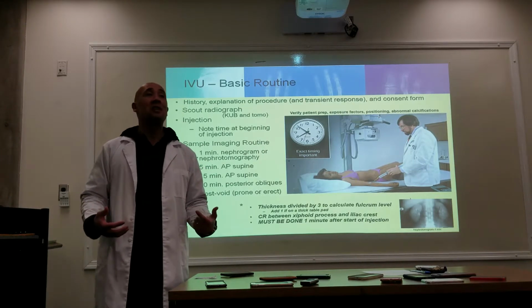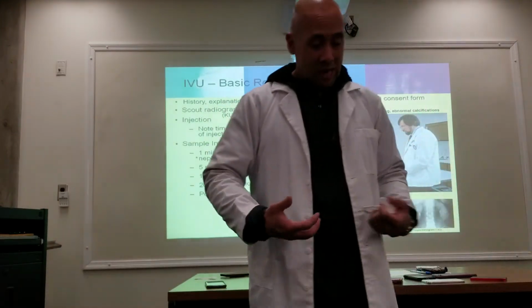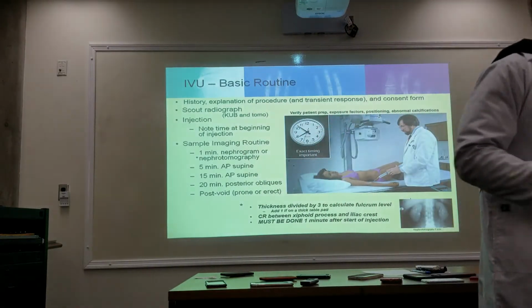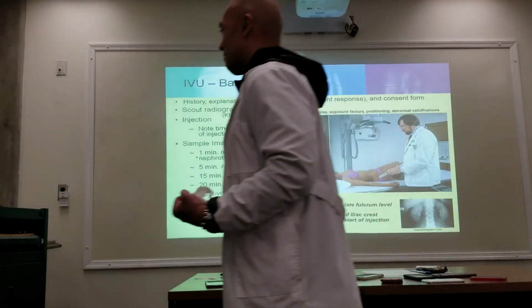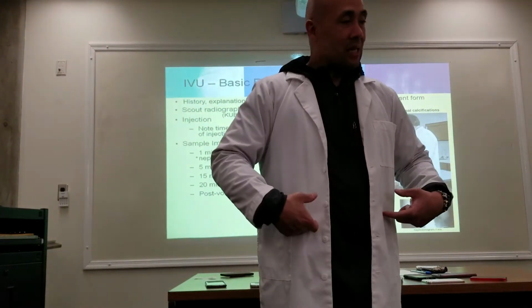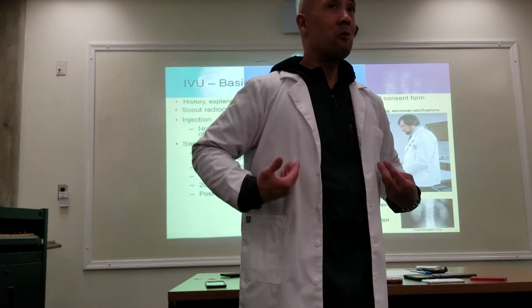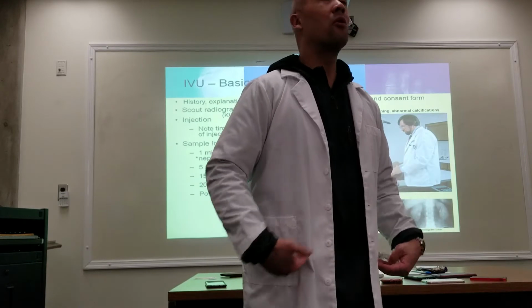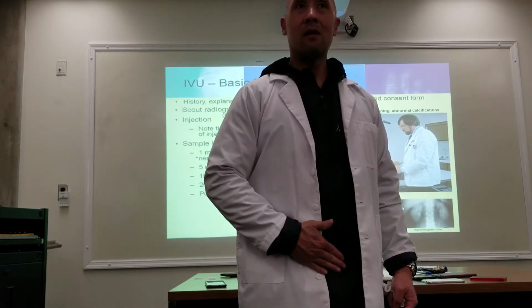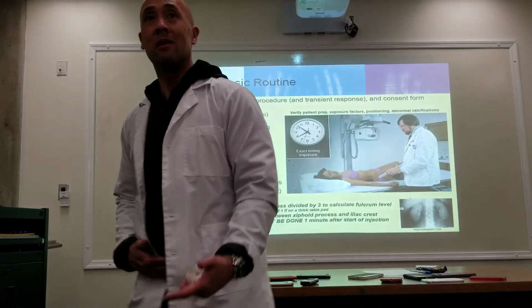But we highly suggest that we don't, okay? Because there are some women who like to wear the panties way up here, the granny panties, okay? The elastic kind of acts like a compression, and you can also see that on a radiograph. We want to, if they are wearing underwear, make sure it's below their waist. More importantly, below what? Bladder. Pubic symphysis, because that's where the bladder is. We're looking at the urinary system.